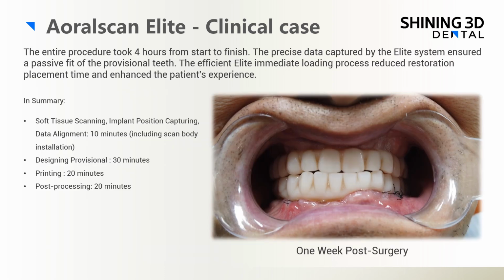For this specific case, the entire procedure took 4 hours from the very beginning to finish. The precise data captured by the Aoralscan Elite system ensured a passive fit of the provisional teeth. The efficient Elite immediate loading process reduced the restoration placement time and enhanced the patient experience.